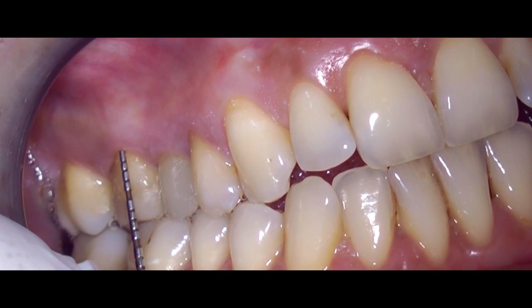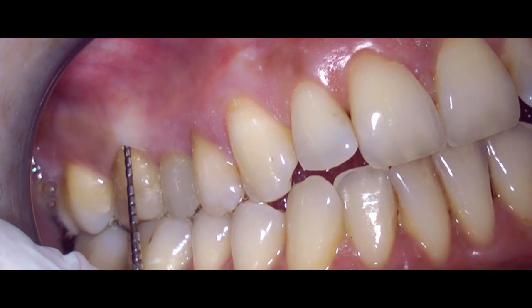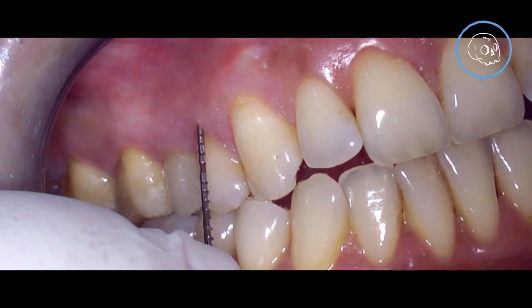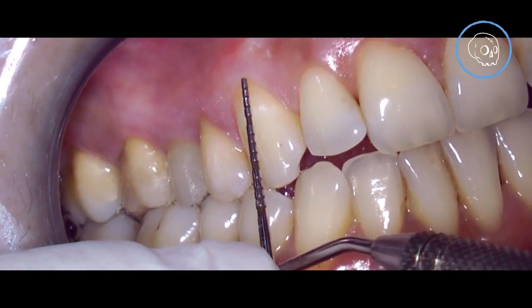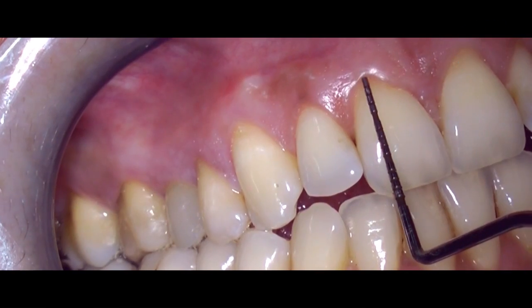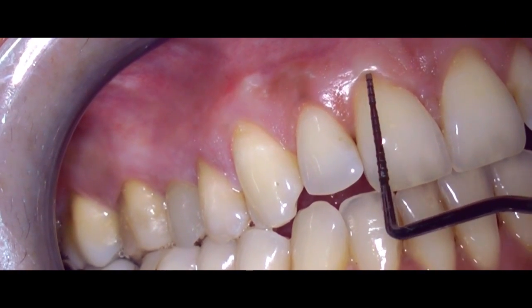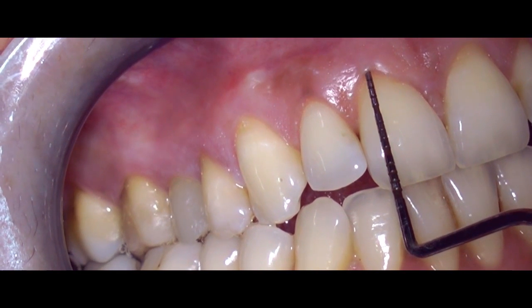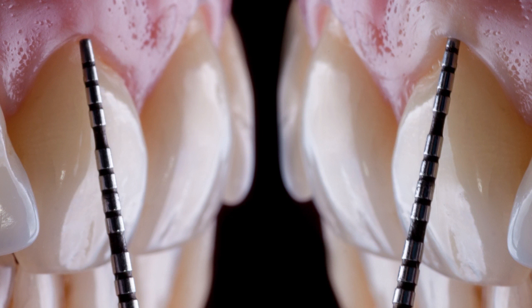In the case I will show you next, we used two lateral approaches in order to achieve root coverage from tooth 16 to 26. We started on the patient's right side and then decided to carry on to the left side upon completion of the first quadrant.